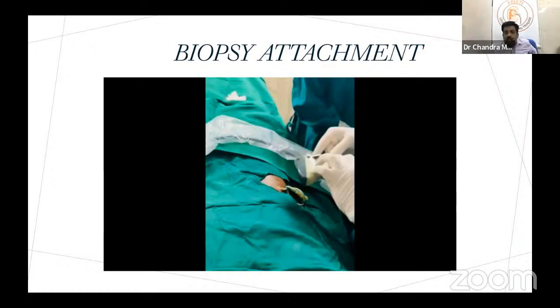I wanted to interrupt once here. Yes, sir. Abhishek, when you put this needle, I am using it now for the last 3 months. When your probe is fixed towards one alignment in relation to the kidney calyx, usually you cut the skin with a blade. Yes, sir. So when you cannot cut once you put it at an angle and then prick with the needle, without cutting the skin it is very difficult. Normally in PCNL you cut. So will you cut the skin and then start probing, or will you probe and then go with the needle?